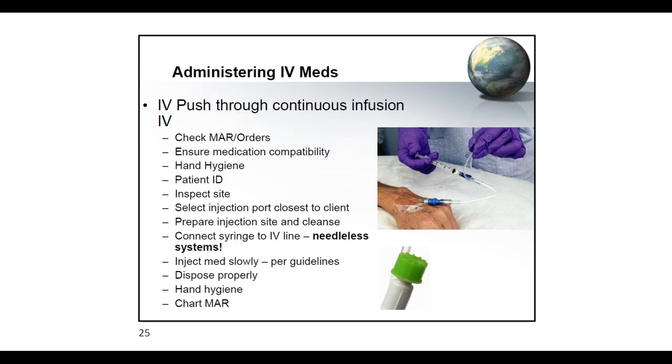Inspect the site, make sure that it's still in a good spot. And my recommendation, if let's say it's been a long time since you assessed the patient or you just arrived and you haven't done your assessment yet, make sure that before you start pushing any drug in that IV, you are flushing it and assessing to make sure that it's in the right place. The last thing you want is to administer a medication that can be very damaging to the vein or to the surrounding tissue, and it's not even in the vein. Then you can cause more problems. So please assess your site before injecting anything.